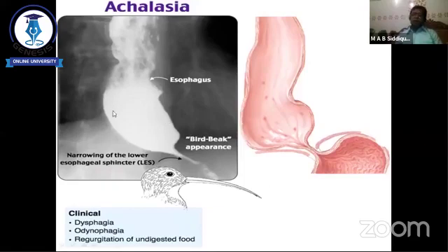This liquid is retained in the esophagus. That's why the gas cannot pass from the esophagus to the stomach. As this is liquid, gas cannot pass through this liquid. That's why the fundic gas is absent. Usually fundic gas is absent.